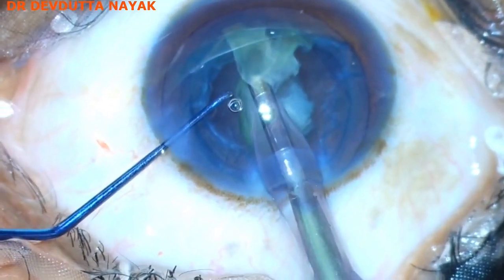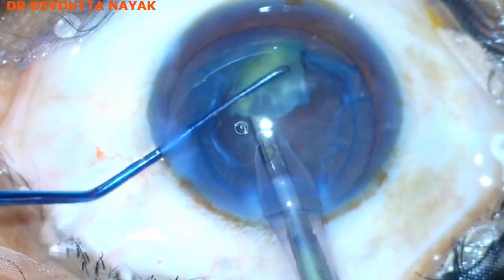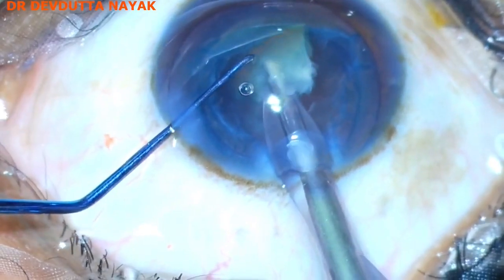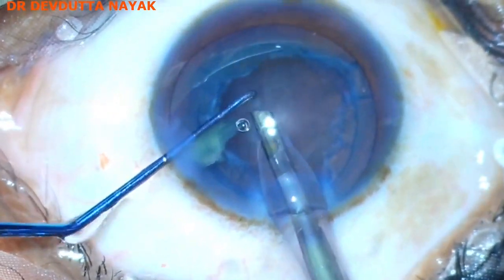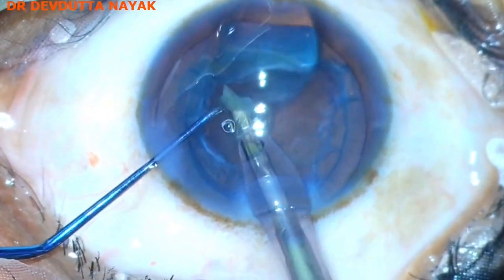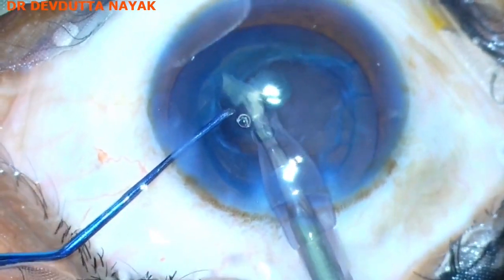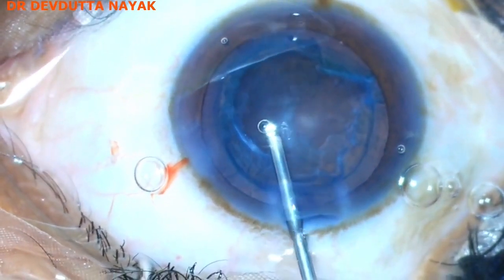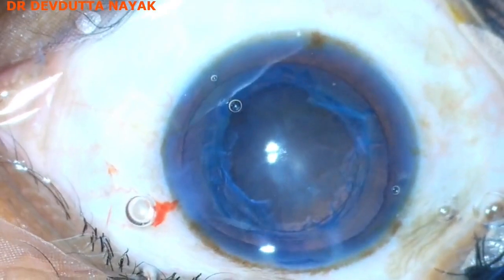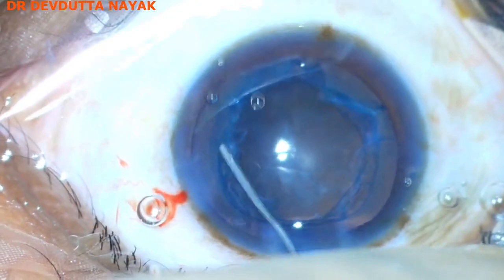While emulsifying the nuclear pieces, one has to make sure the pieces won't hit the endothelium. One must be very careful while removing the last piece because the chances of surge are pretty much higher during the removal of the last piece.